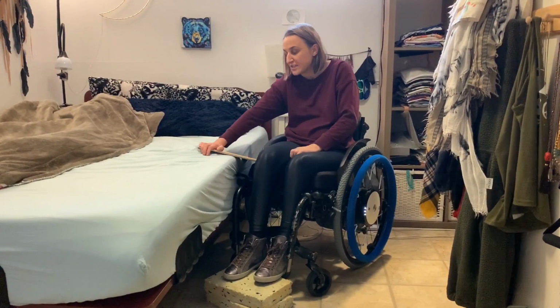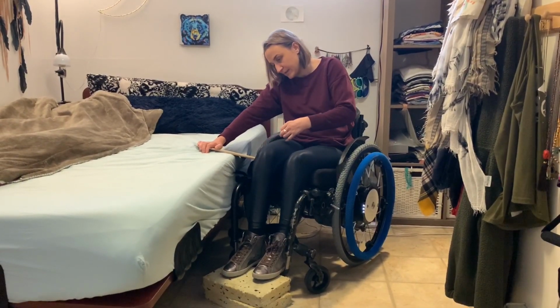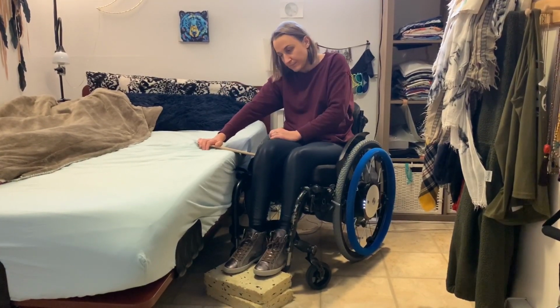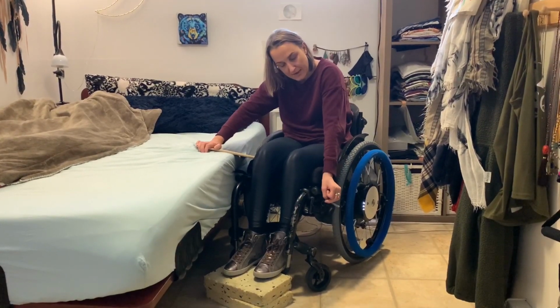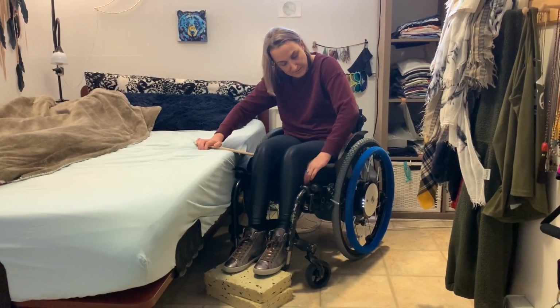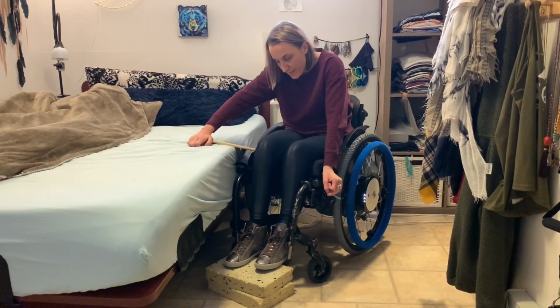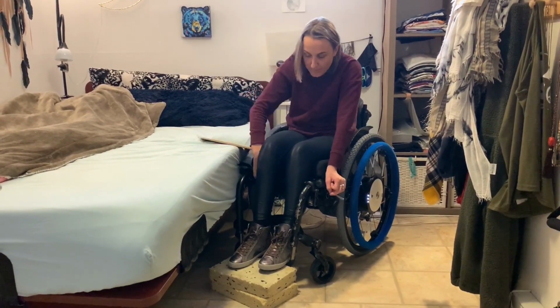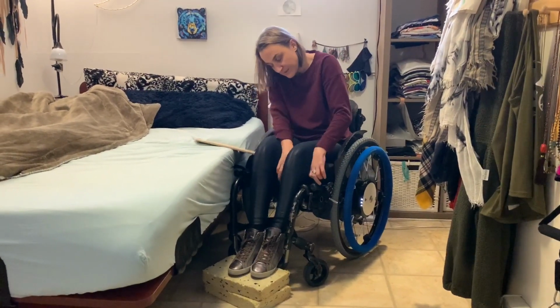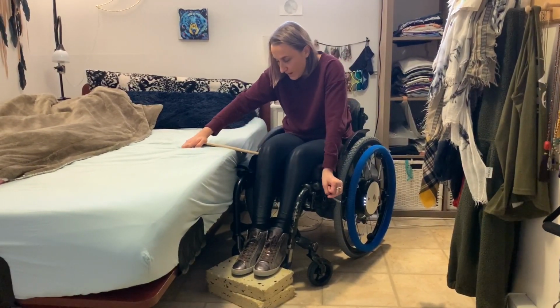Okay, and then for transferring, the first thing I'm going to do is shift my weight to the front of my chair, so I can start building momentum to move to the side. To do that, I normally put my hand either on my brake here, or sometimes on my seat, depending on where I'm transferring. I find the brakes easier going onto my bed, so that's the way I'm going to do it. I also try to bring my legs out, so it gives them more room to move around.